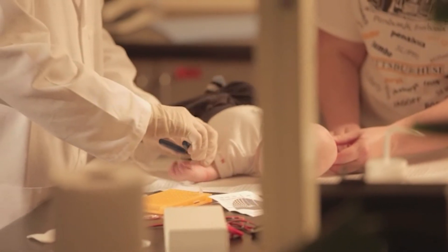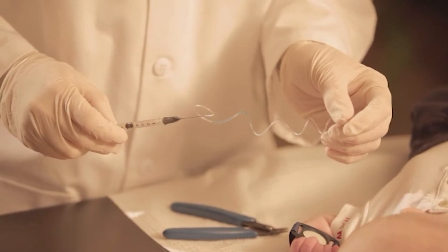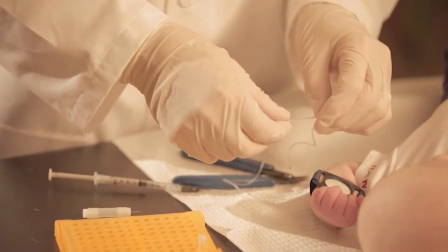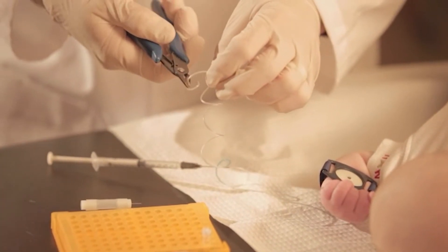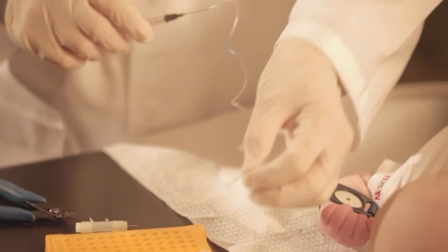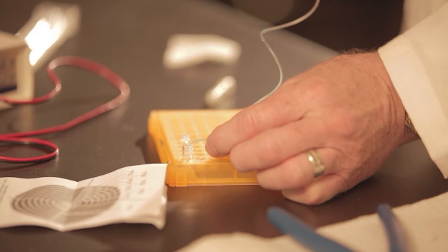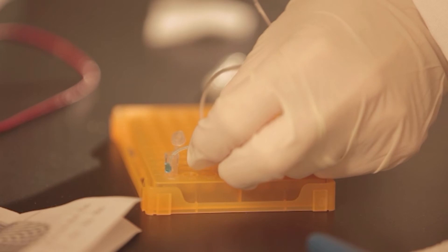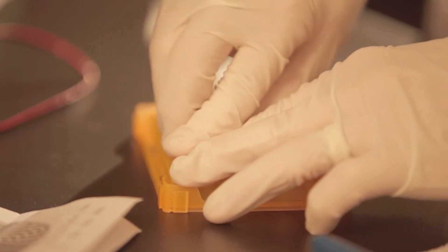You can touch the needle as long as you don't touch the tip. Uncoil the collector tube all the way to the center, leaving the center of the tube attached. Use the nipper to cut the tube at the base closest to the center of the collector. If the sweat did not fill the collector tube entirely, slowly pull back the sweat about one inch. If the sweat filled the tube entirely, do not pull back the sweat. Use the nipper to cut the end of the tube back about 0.5 centimeters to reduce the curve. Put the tip of the tube into the small sealable container provided with each kit and slowly and gently expel the sweat into the container.